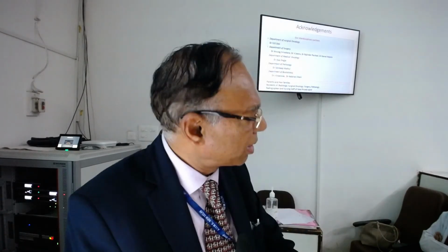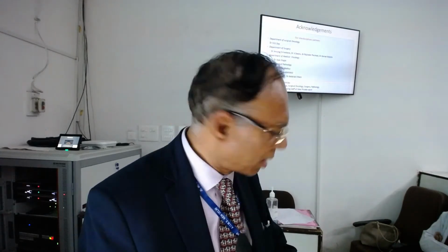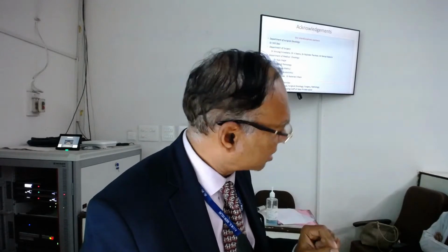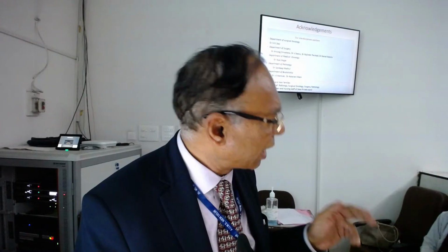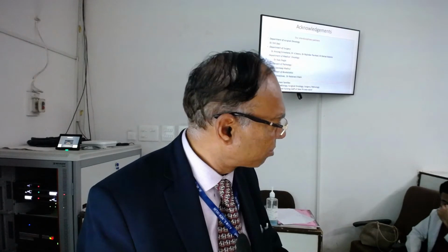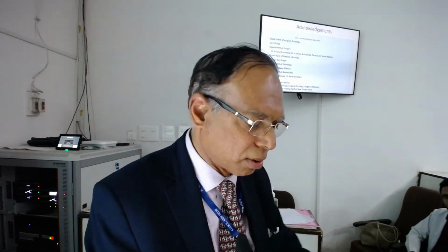And again, MRI is very good, but one more indication for MRI could be evaluation of ladies who had silicone implant based reconstruction. So I encourage the young Dr. Kirtika and her team for developing AI, and they can take 2 more research questions in AI evaluating multicentricity. So if you have doubtful multicentricity, you can use your AI tool to avoid negative biopsies. And again, in evaluating recurrences, you can use AI to avoid unnecessary trauma and tension.